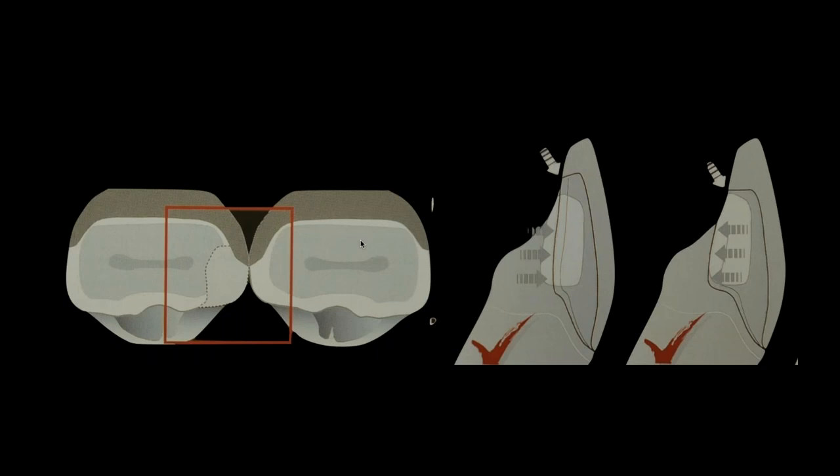The other thing that I want to always manage in these cases, and I know a lot of us talk about this, I hear it in lectures, and people always ask me, do you break contacts on the veneers? And the answer is yes and no. And that really depends on the orthodontic position of the tooth. If I don't have to break contact, I don't want you to break contact. I don't want your doctors breaking contact if they don't have to. But if you're changing the shape or the form, or orthodontically the teeth are a little out of position, you have no choice but to break contact, bring your preps further back to the lingual, and elbow out your preps so you can get a little bit more depth for the emergence and to cover up the pre-existing tooth.